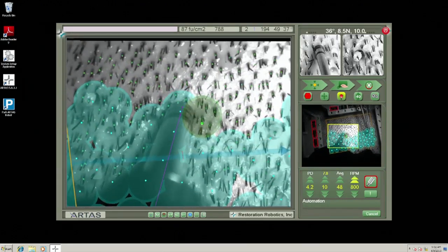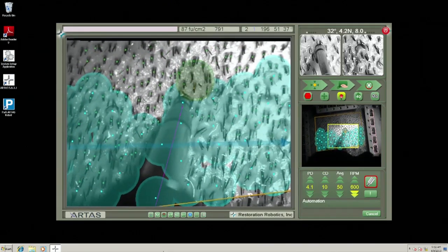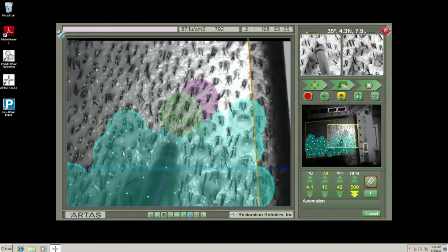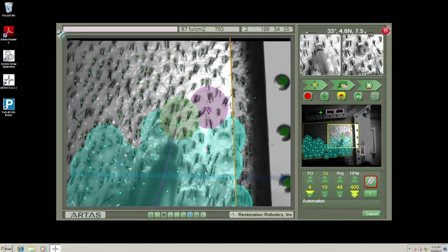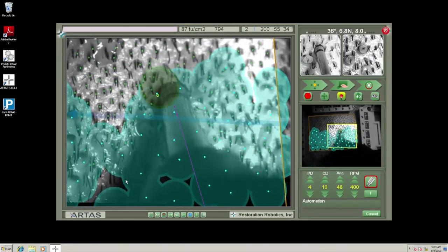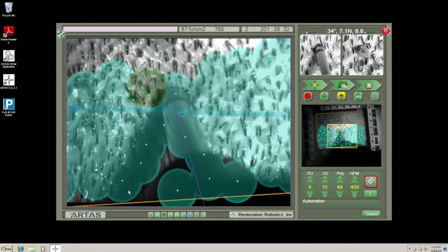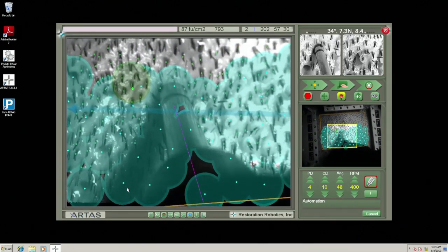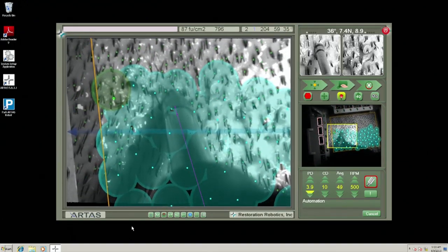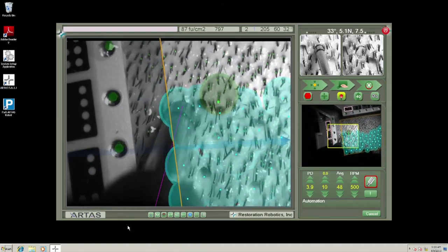I had a traveler who came in on Tuesday, for example, from Mississippi, almost a 10-hour drive from our home base, who came for a body hair transplant. And as you know, the robot is not approved for body hair transplant yet. This was a day where I was doing 800 grafts of body hair transplantation, and I was exhausted. I had almost a tension headache from exhaustion, and then brought him back the next day and did another 800 grafts of body hair. So there's a fatigue factor, first of all, for wear and tear on ourselves.